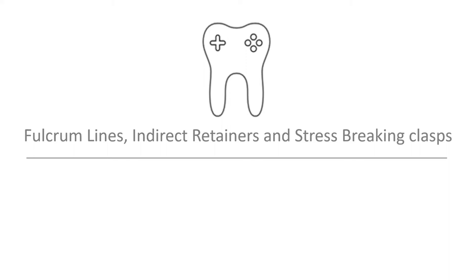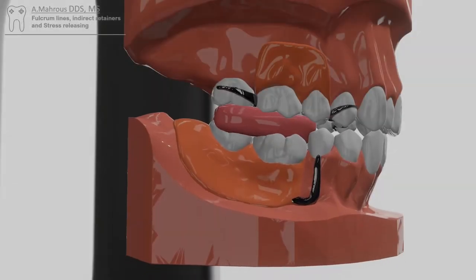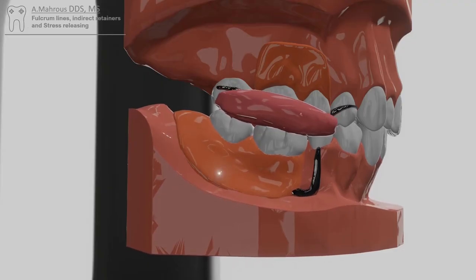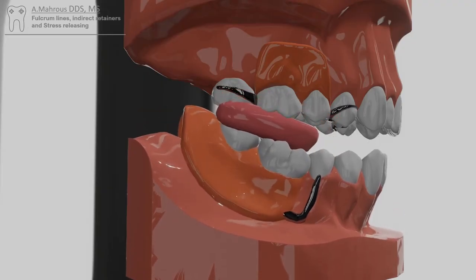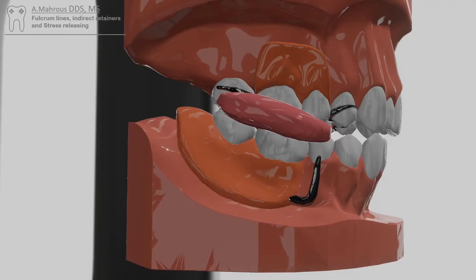Hello and welcome to another RPD video. Today we'll be discussing fulcrum lines, indirect retainers, and stress breaking clasps. Removable partial dentures are not fixed restorations. Because of this, they tend to move around during function, as seen here in this animation.